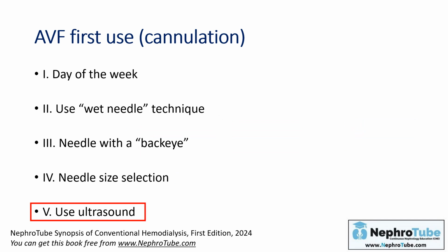Finally, the use of ultrasound. This is recommended by KDOQI 2019 and European Renal Best Practice Guidelines 2019, that it is reasonable to use ultrasound for proper needle placement in fistula, and it should be performed by trained operators to prevent cannulation complications. The use of ultrasound for AVF cannulation can be done for first use cannulation and also for regular cannulation, as I will mention now.